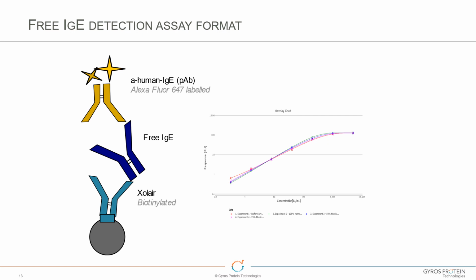So in this case, we used a stripped matrix, so an IgE free matrix. To be honest, by stripping the matrix, you're removing interferences, so it's really only a surrogate matrix. But in this case, we managed to demonstrate that using 100% surrogate matrix, we got a good standard response, and as we diluted that, we got very parallel curves. So that was a good starting point for assay development. The next key was when we actually take serum samples, can we demonstrate parallelism and ensure that we get accurate determination at 100% matrix.